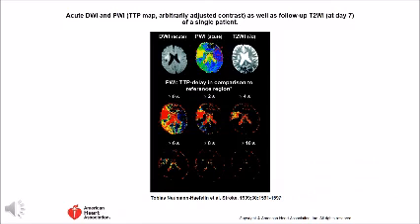This diagram shows diffusion weighted image and perfusion weighted image at different time points. It also shows T2 weighted images after 7 days in the same patient.